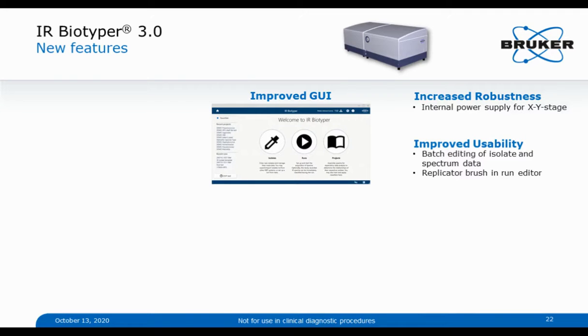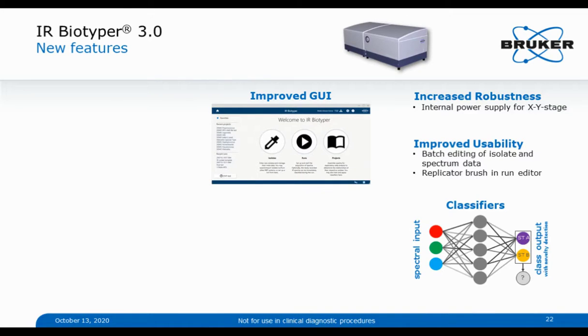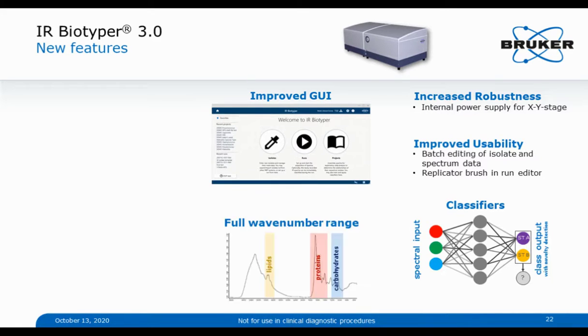improved usability in the usage of the software, especially important, the introduction of a new workflow in parallel to the classical hospital hygiene workflow. That is the implementation of building of classifiers, of machine learning to create classifiers and apply classifiers. I will guide you through this later.